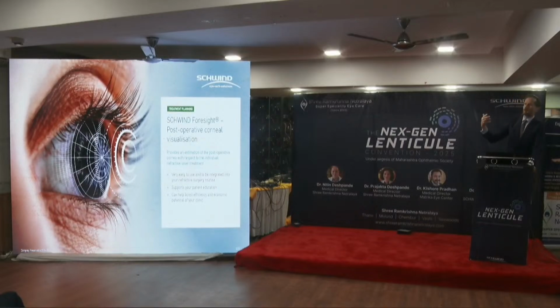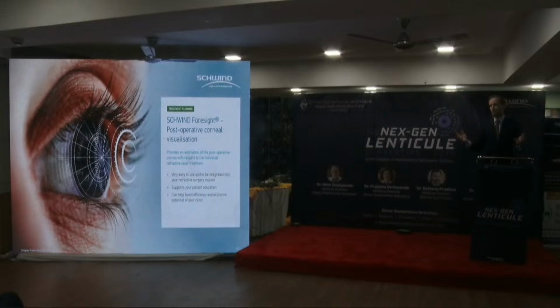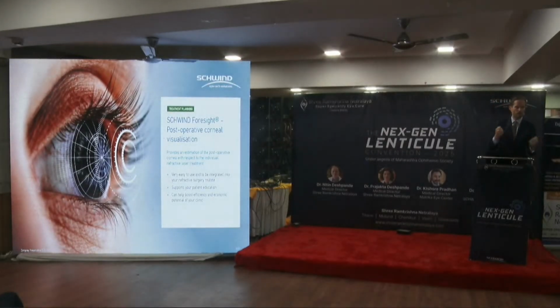Foresight, I mentioned, so looking into the future, that's the start. Now the first edition is about next day planning before you do your surgery, and the target is to evolve that and collect more data and have a tool where epithelial regrowth is included, and where you can look at 6 months or even 12 months post-op before doing your surgery, and then adjust your surgery and simulate that and understand what's happening to your results.